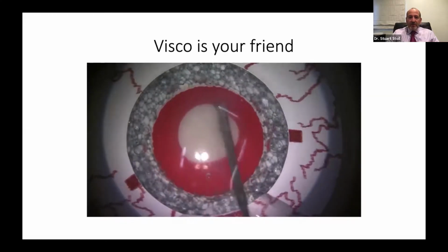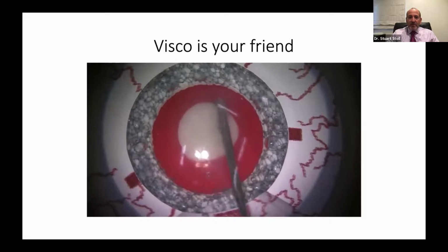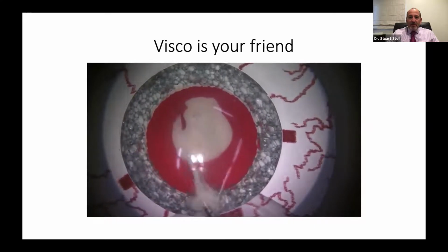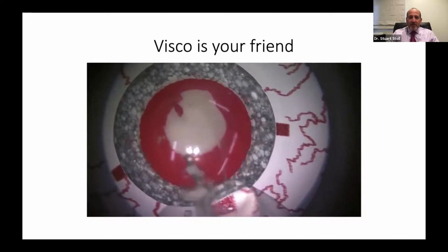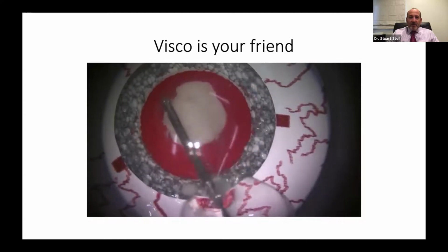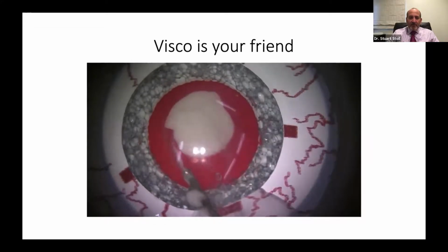So here's a case where we had too small of a rhexis. We reinitiated with the scissors. Now we're grasping it. Look, I've gotten down into the cortex. I've fluffed it up. It's hard to see. Take a second, put some viscoelastic in, clear your view, and then continue on around.